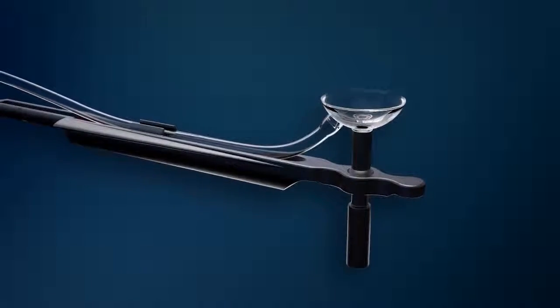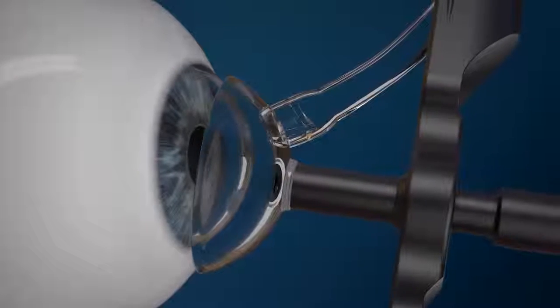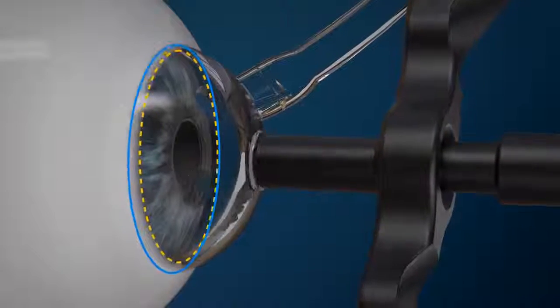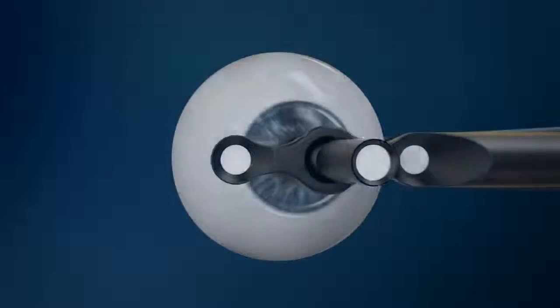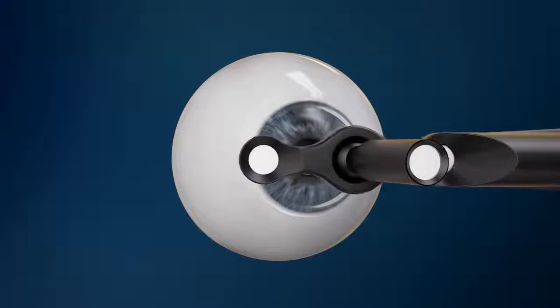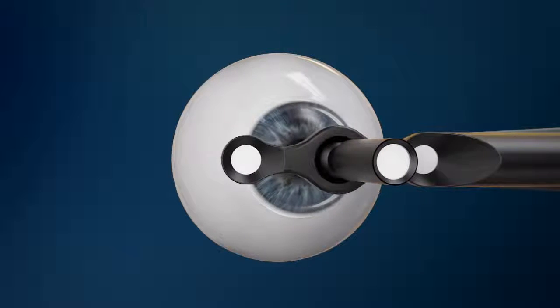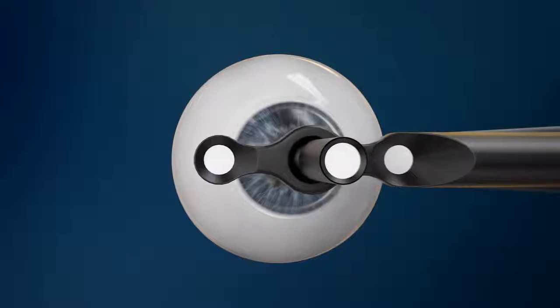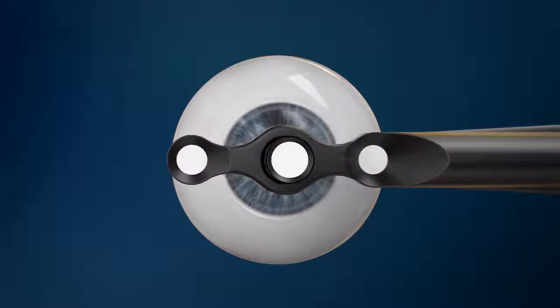The proprietary eye guide lens is positioned by the physician. The lens is aligned to be concentric with the limbus, facilitated by tracking software. A gentle vacuum ensures eye guide coupling to the sclera, allowing eye stabilization and manipulation by the physician. When accurately positioned, the center eye guide post represents the patient's optical axis. The eye's orientation is adjusted to establish accurate alignment between the patient's optical axis and the IRay system.